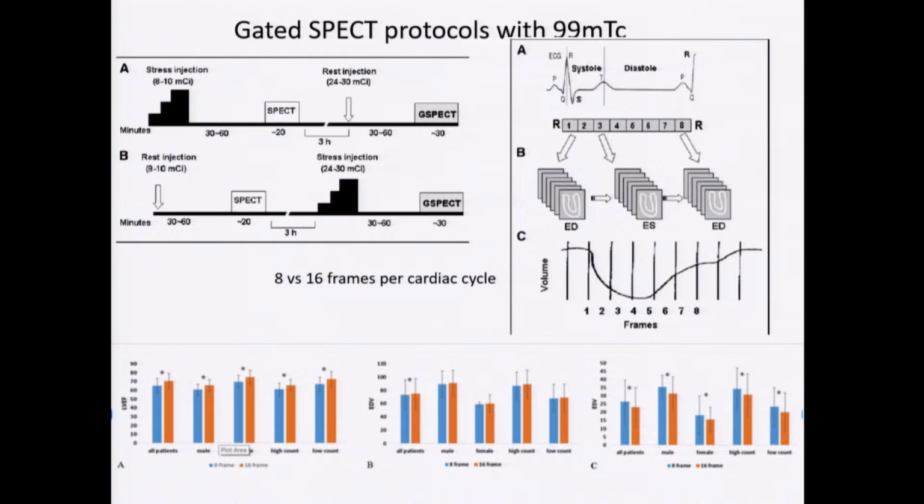With nuclear imaging, you image the patient over, depending on the protocol, 12 minutes, right? So you put all the beats in different bins, and compress and compile them into one single beat, okay?